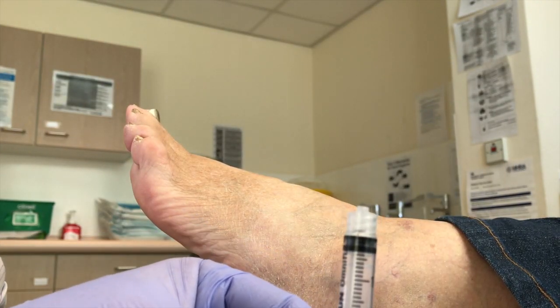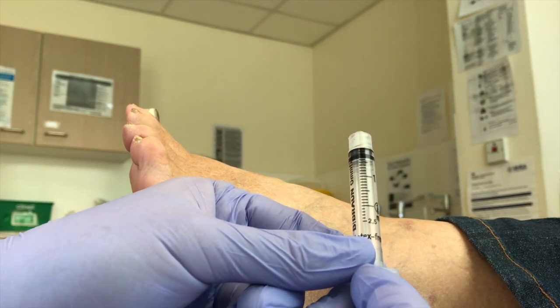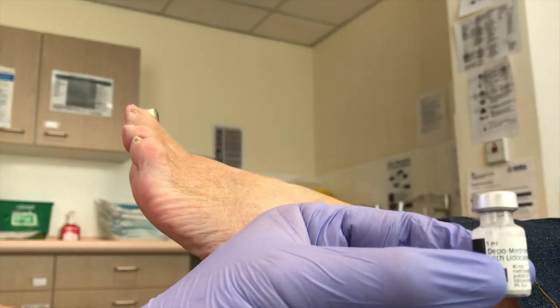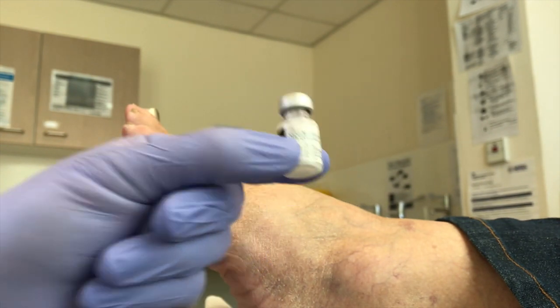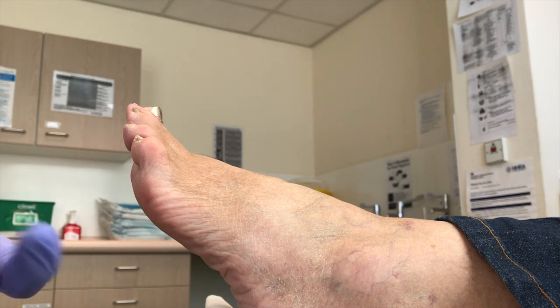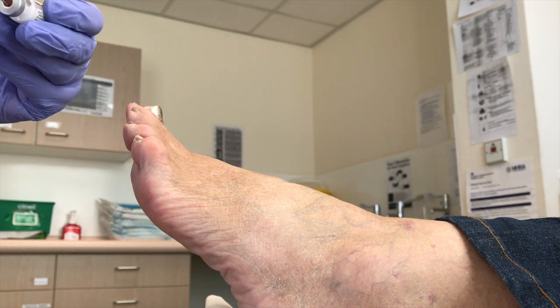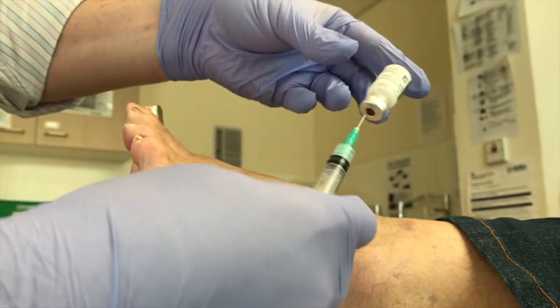Nice small syringe — a 2.5ml syringe will do it quite nicely. We're going to use Depomedrol. Sorry guys, I'm floating about. I need a cameraman today but I haven't got one today, so it's one camera propped up, one pair of hands. Somebody — and I won't say who, Sharon — from my team left our nice fancy camera in theatre. Never mind, we get the idea. Bit of Depo.